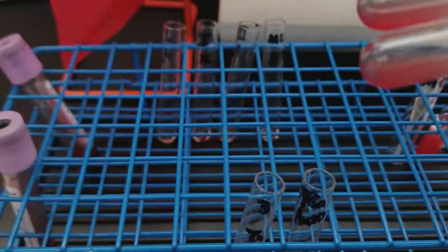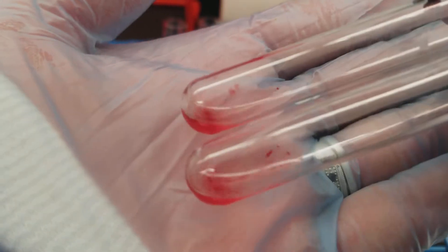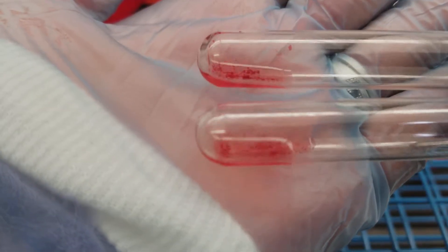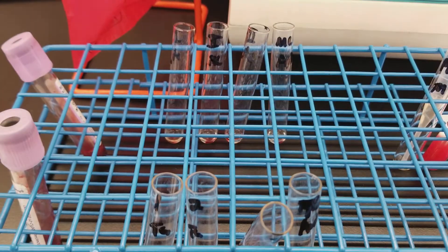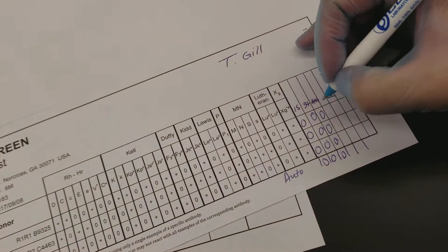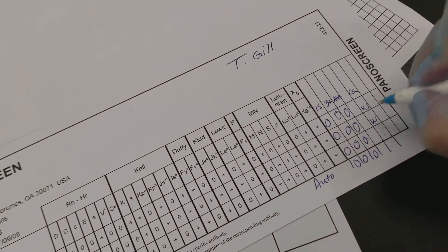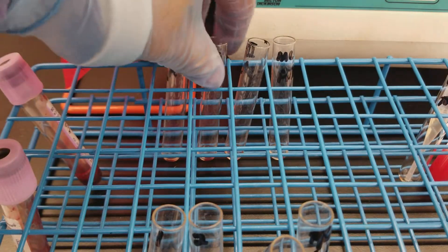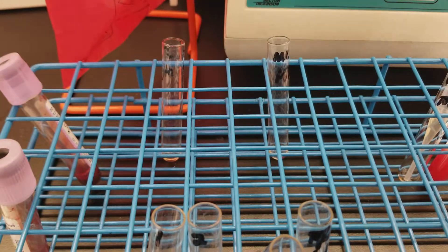Do you see it now? There are positive little agglutinates in there — I'm sorry, they're so tiny. Looking at the last two, there's like a 2+ in each of those. So let me write that down: weak, weak, weak, and then 2+, 2+. That's for the negative patient — it turned out the way we expected, except for those weak reactions.